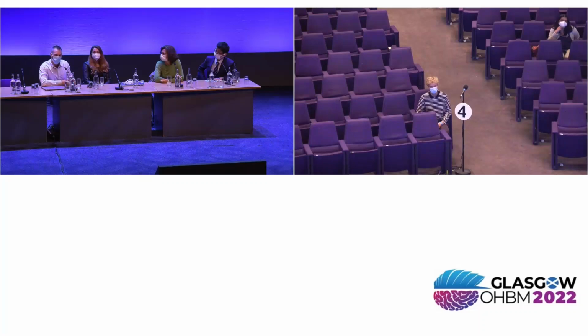My intuition, having used it and FreeSurfer's registration, which is structural only, is that they're pretty similar for most research, but they're not identical, and that the FSLR template is better for certain things. I can't comment as to whether it's always better. I just know it's better for some things. But my intuition about the question of whether we should continue using structure or structure and function is that you use them for different things. If you want to isolate structural variability, you want to align using FreeSurfer. If you want to get maximum alignment between subjects, you would probably want to align using both function and structure.